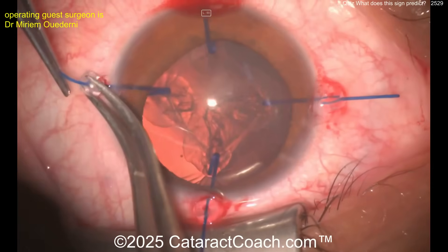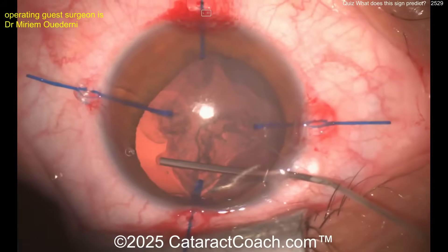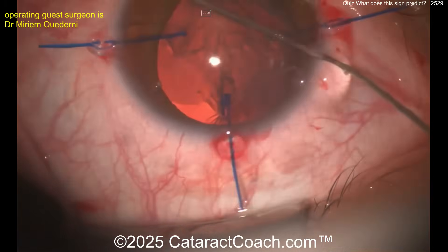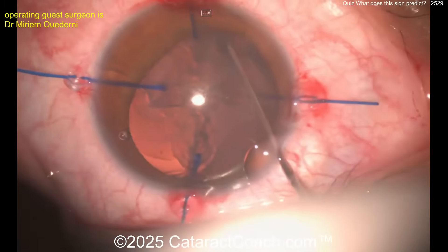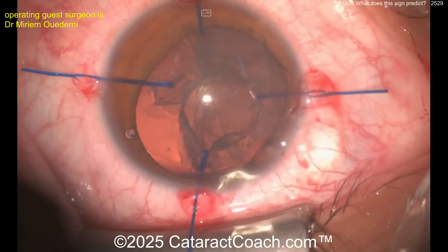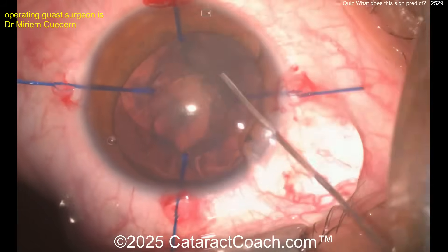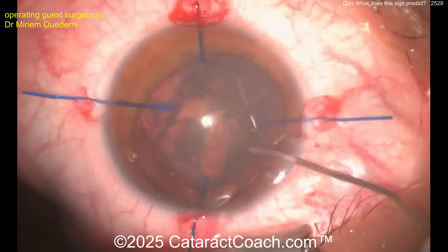The surgeon is going in here with four iris hooks, which is okay to hold support for the anterior capsule rim. Little gentle hydrodissection — fortunately not a very dense cataract here. I prefer to use lens capsule hooks, which are a little bit different, but you can certainly use the iris hooks.